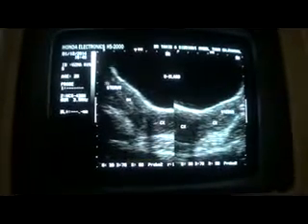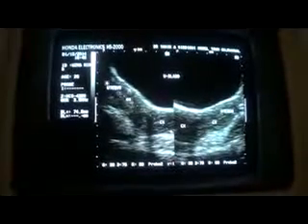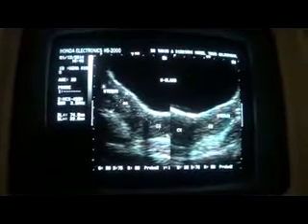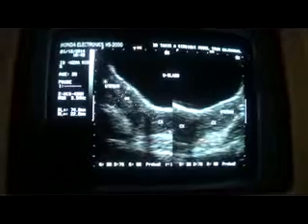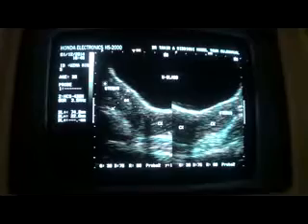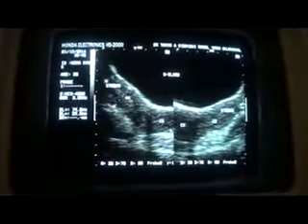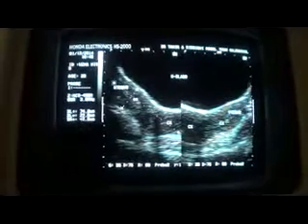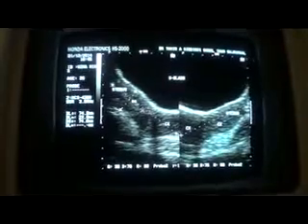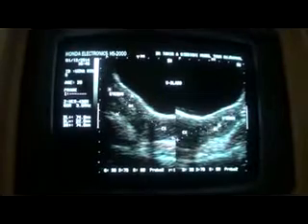Now the uterine didelphys with two cervices, two uterus, both having their own cervices, and the size of both the uterine bodies in anterior-posterior diameter is relatively small compared to what should be the normal. This is the endometrial canal. Sorry, I mislabeled.